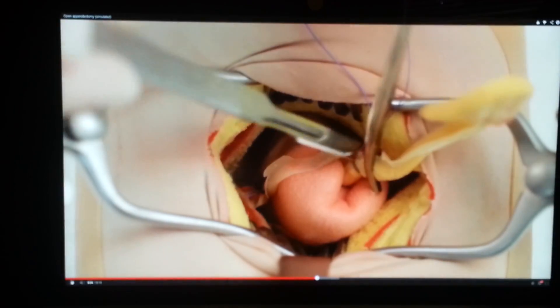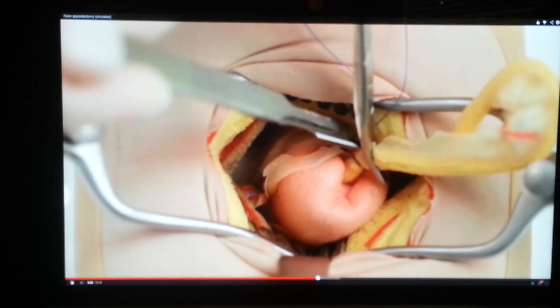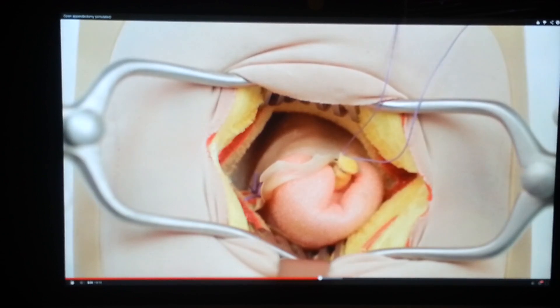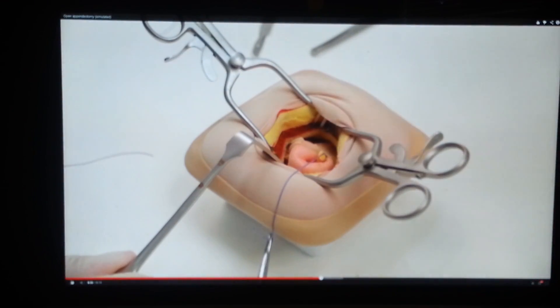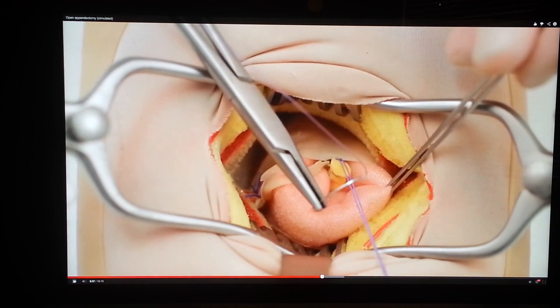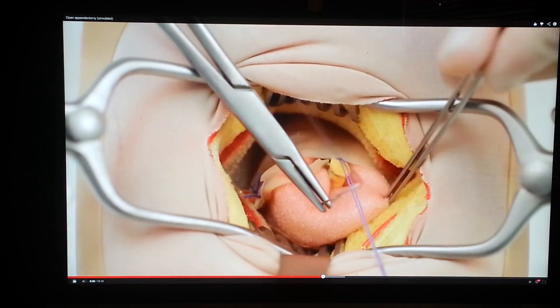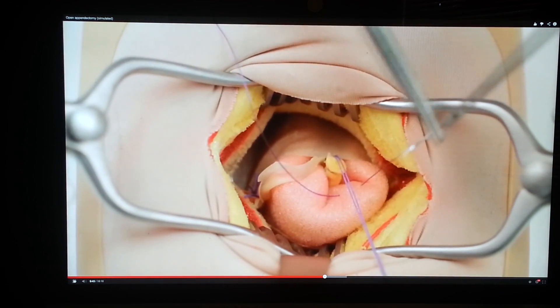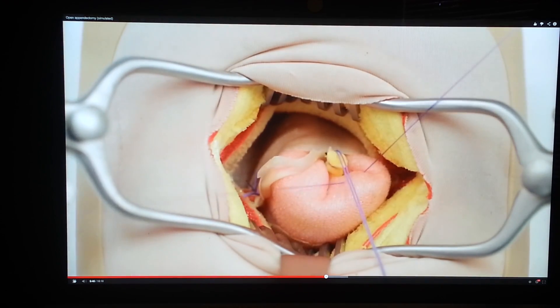Divide the appendix just proximal to the haemostat and place these instruments in a dish for contaminated articles. Insert a seromuscular purse-string suture of 2-0 PDS or similar material on a round-bodied needle encircling the appendix base.